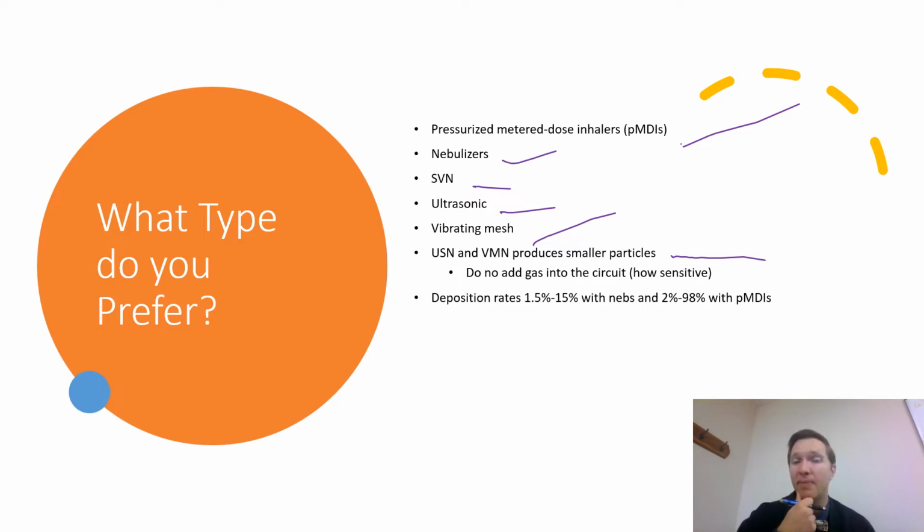Especially if we have a very bad pneumonia and we're doing a Pulmicort nebulizer, right? We need to have a smaller MMAD, a mass median aerodynamic diameter, right? We need a smaller MMAD for that because the area that's inflamed is more the transition and respiratory zone. We need that area to get most of that medication.